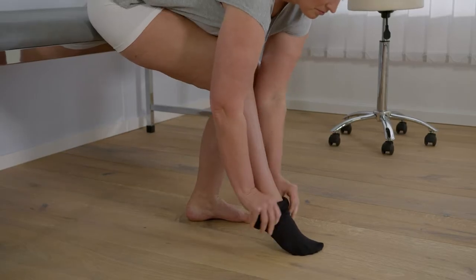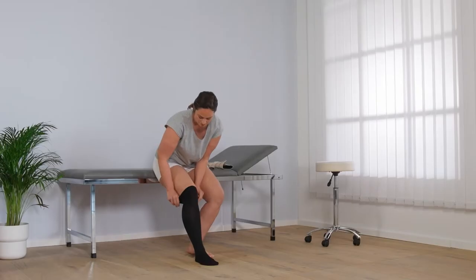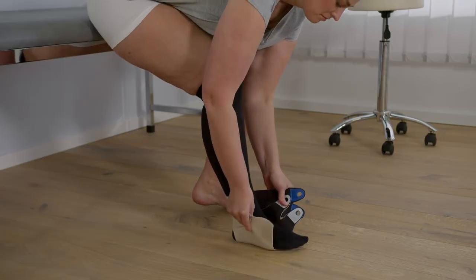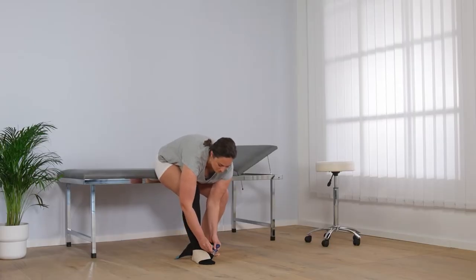Slide the knee-high ReadyWrap Liner, which is supplied with the foot and calf garments, onto your leg. Position your foot in the product. The coloured fasteners should be facing up. Align your heel in the heel opening.